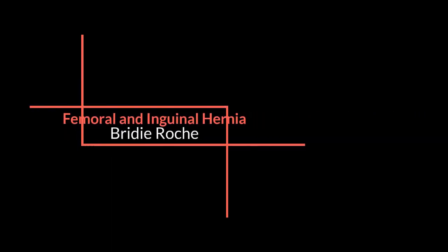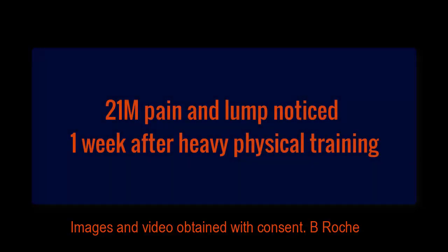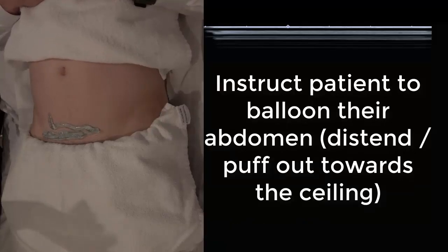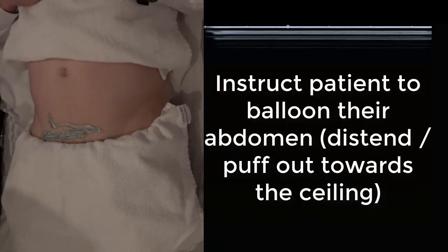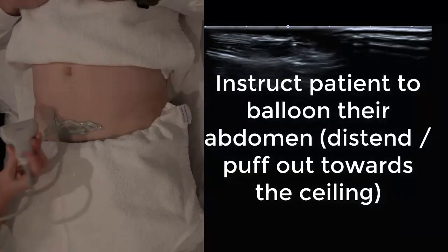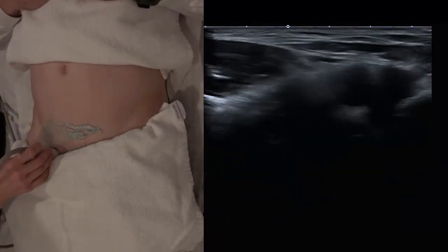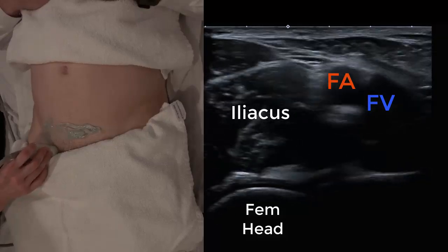In this video I'll be showing you how to do the technique for femoral hernia assessment. We'll just do one side at a time. We're scanning a 21 year old male who's consented to this video. The first thing to do is to train the patient how to push properly. Have their arms resting on the chest — you don't want the arms stretched up over the head. Anything that will engage the abdominal muscles is going to mask a hernia.